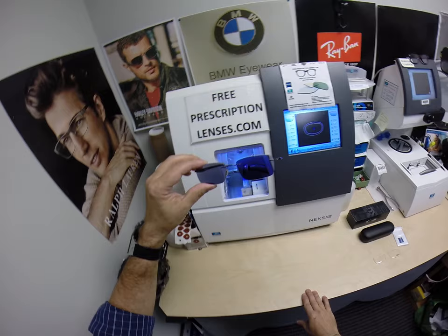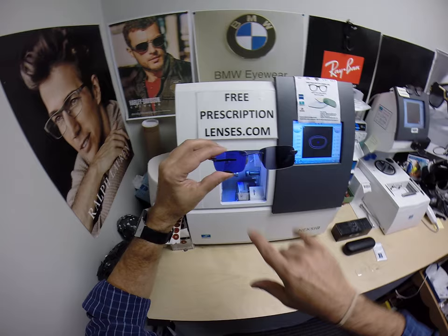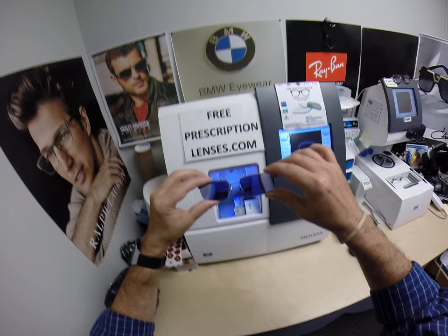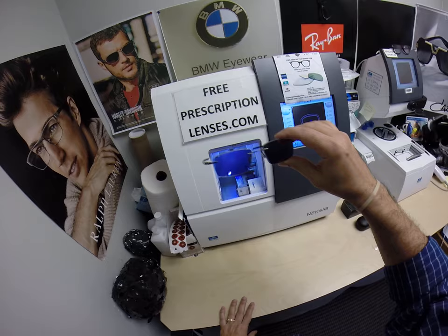Now the transitions from Zeiss are available in gray as you see here, brown, green, and blue. There's also the extra active gray, which is only available in gray. I can do the flash mirrors. I can do a polarized sunglass with a mirror coating if you want these to be devoted sunglasses.